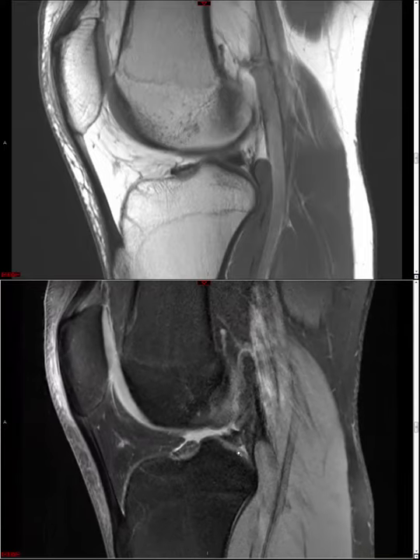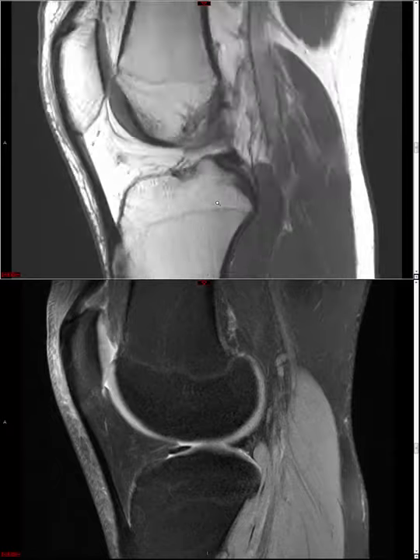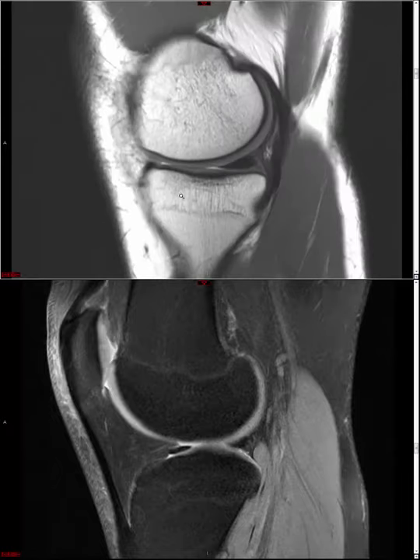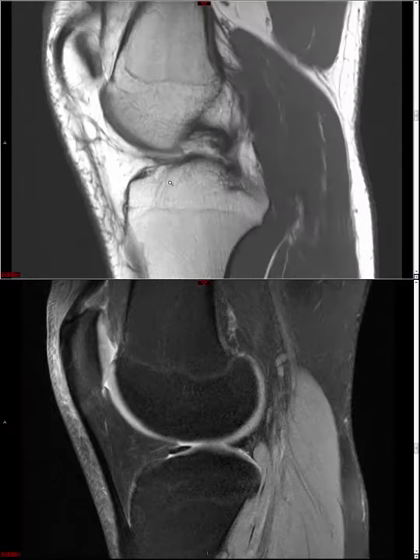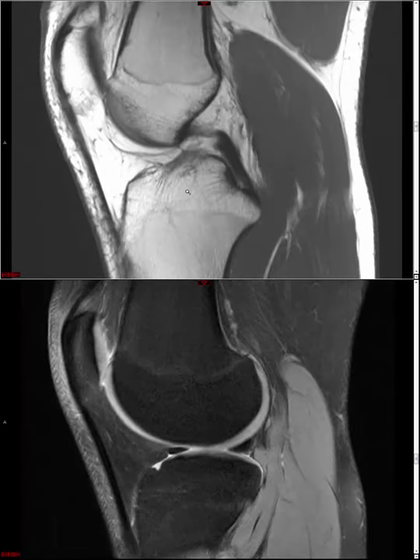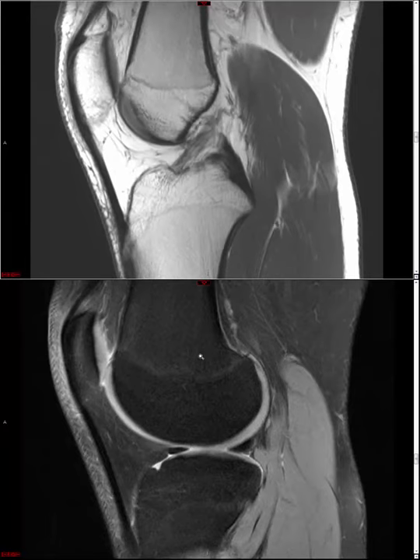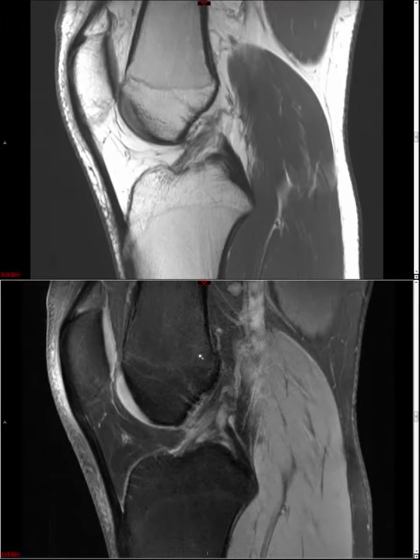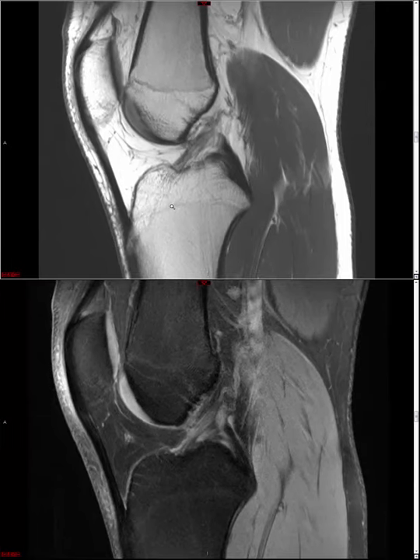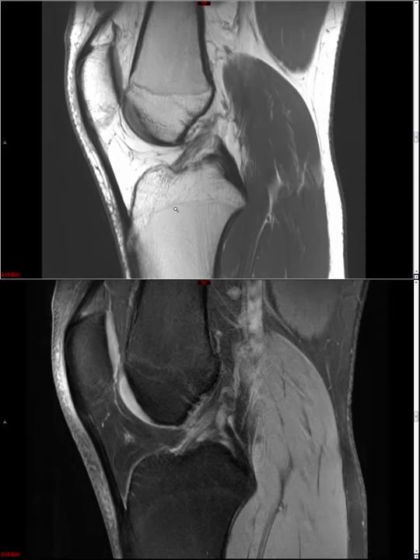An analogous situation happens anteriorly, so we have a structure known as a transverse ligament that runs from the anterior horn of one meniscus to the anterior horn of the other meniscus. Here, admittedly, we don't see it well, and if you don't see one of these smaller ligaments, I wouldn't worry too much. We emphasize this because we just don't want people to erroneously misdiagnose meniscal tears, mainly.